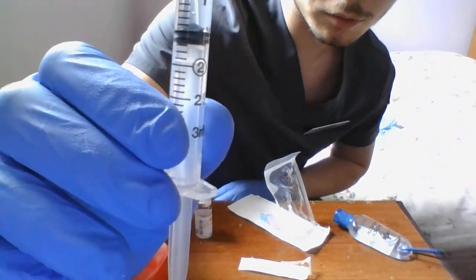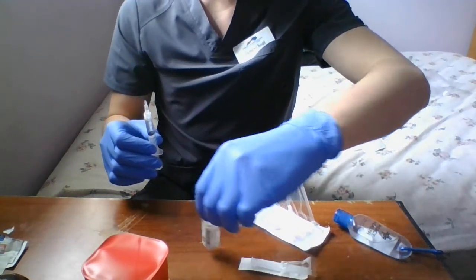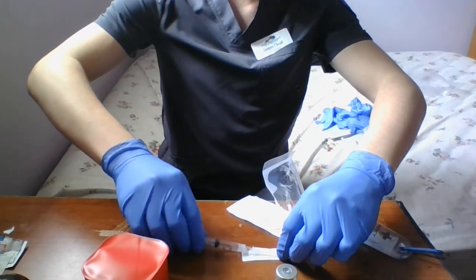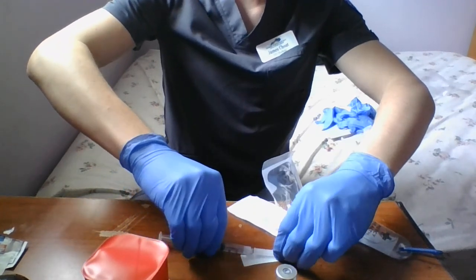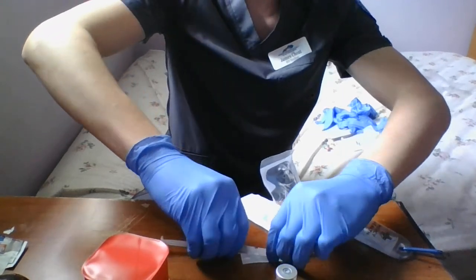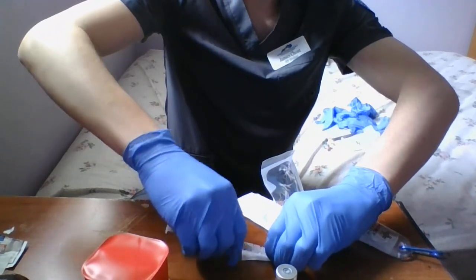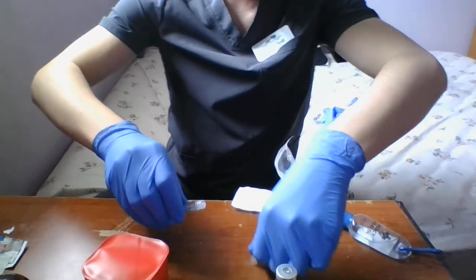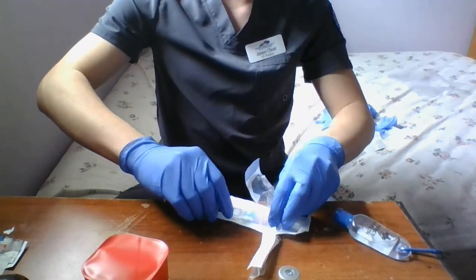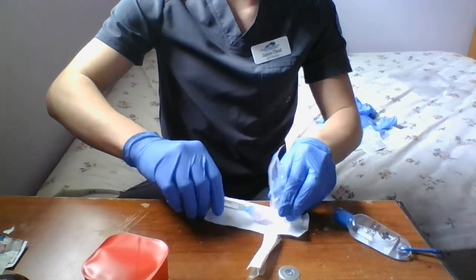It's drawn to 1.5. I'm going to do what's known as the swooping. I'm going to take off the blunt tip. Blunt tip is off, and I'm going to begin by putting on the actual needle.